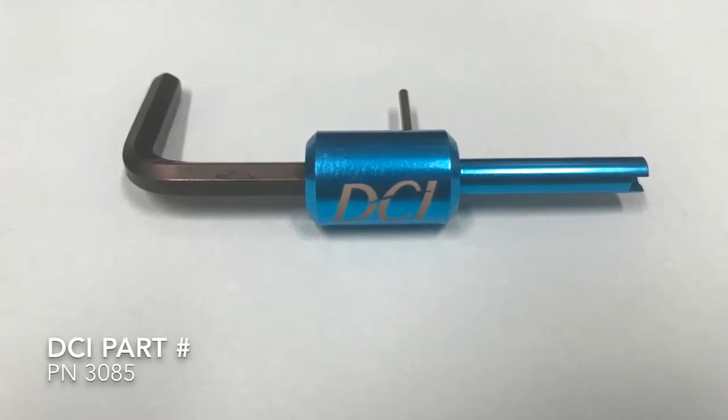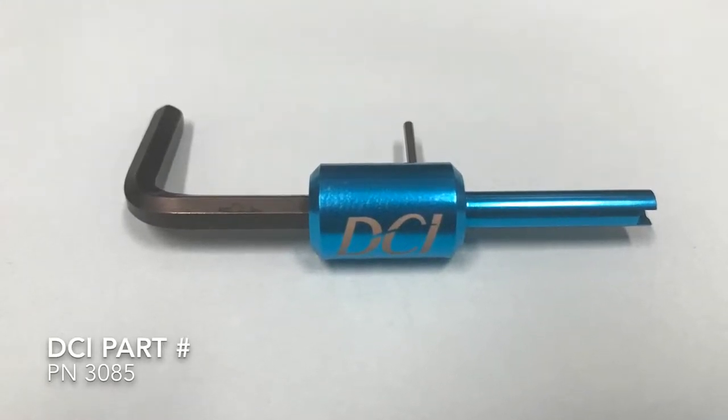Hey guys, it's Eric. Today I'm going to show you how to change out the buttons on your air water syringe. We're going to use the DCI part number 3085 air water syringe tool.